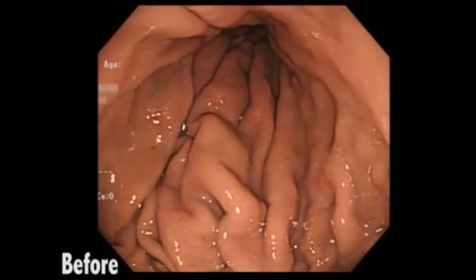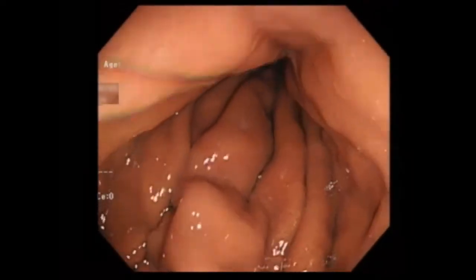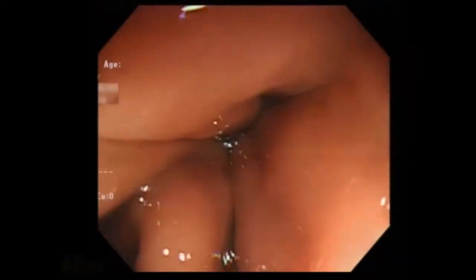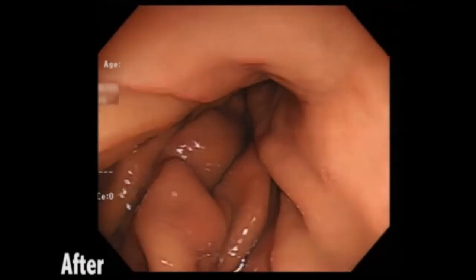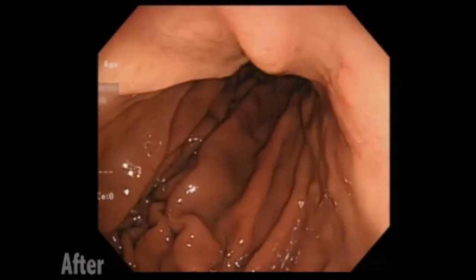During EGD, despite continuous air infusion, the gastric wall did not extend sufficiently because of frequent deflation. After we applied cricoid pressure, the gastric wall was fully extended without deflation.